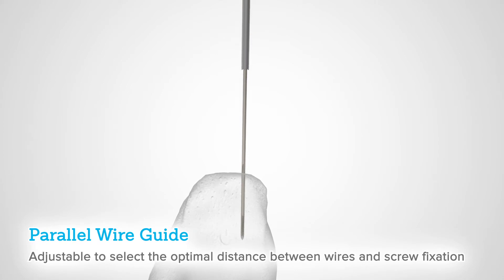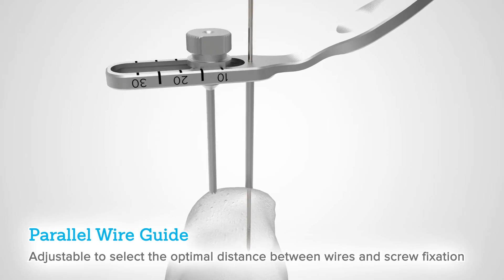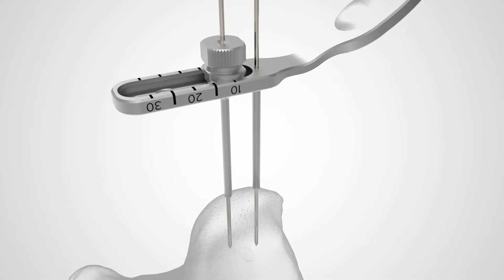The parallel wire guide allows for placement of two threaded or smooth parallel wires. The drop-in cannula can be assembled after initial wire placement, then adjusted to select the optimal distance between wires and ultimately screw fixation.